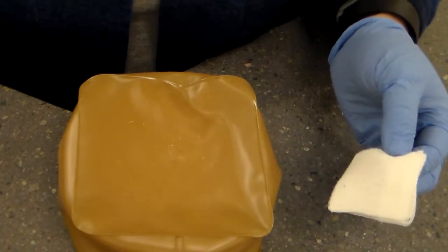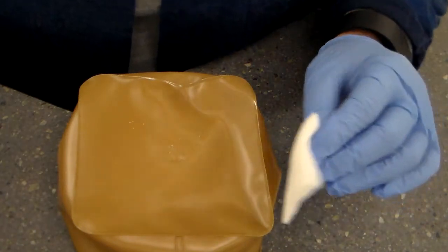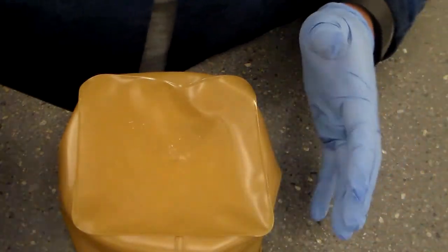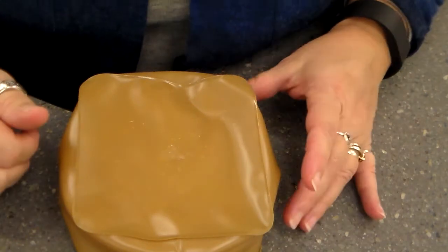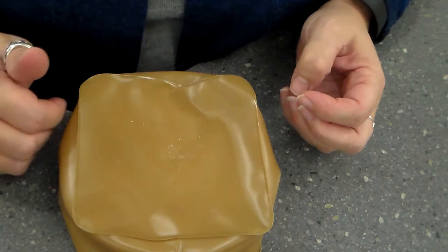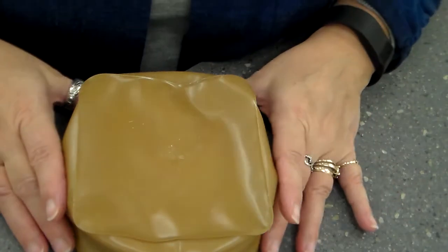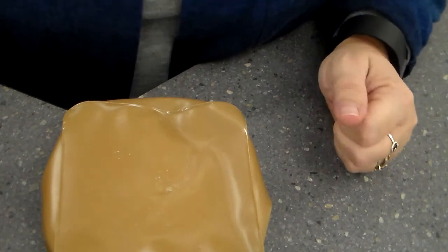We're going to make sure that the site is okay and not bleeding. We are going to assess our patient, make sure that they are okay. We're going to remove our gloves and perform hand hygiene. We're going to document on the MAR the medication, the route, the date, the time, and our initials. Then we are going to make sure our patient is comfortable before we leave them and do all of our wipes for when we leave.